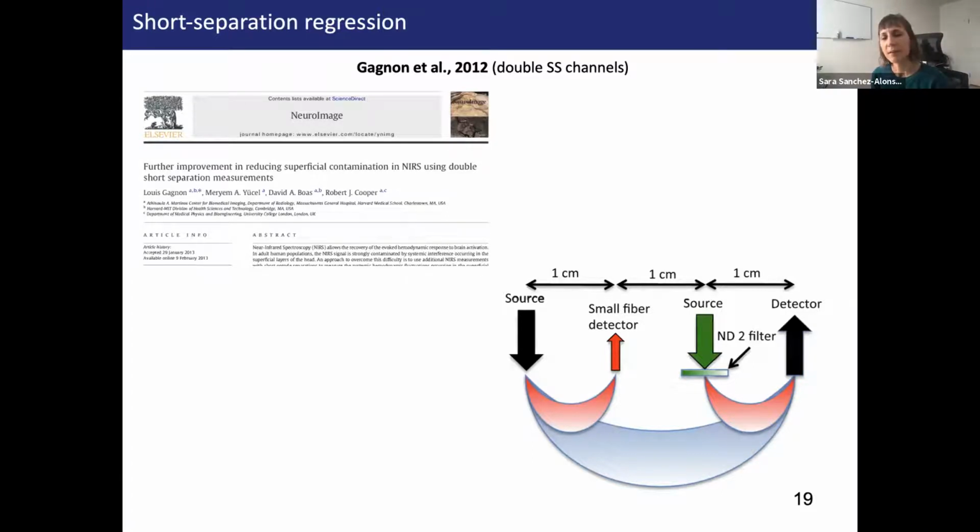So in that scenario, you greatly reduce the risk of filtering out your brain activation with a spatial filter, right? That is the reason we stopped using it: 15 years ago we had smaller probes, and so 50% of the time we were filtering out our brain activation or greatly reducing it. But now that people have whole head coverage, that risk is greatly diminished.